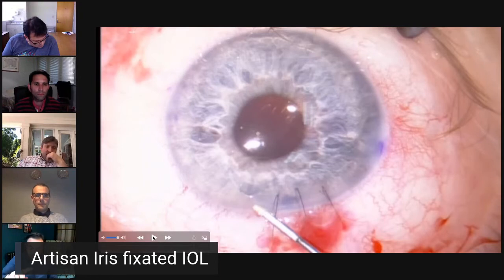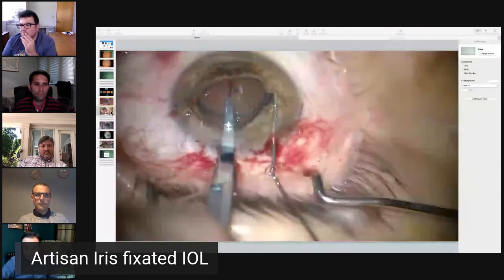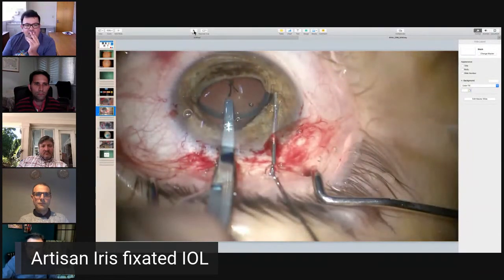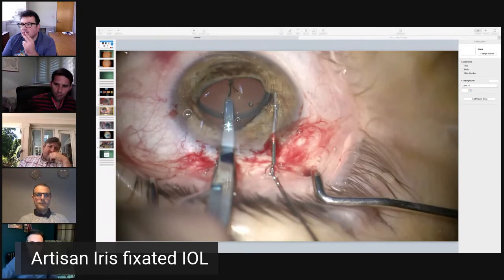One thing, if you don't mind me mentioning, Ahmed, is that you need specific long-tongued forceps to be able to manipulate those lenses. Not any forceps will be able to manipulate those lenses appropriately. Also, one thing I do differently from before is that I tend to use Vicryl sutures nowadays, which dissolve. They're not going to last there for a long time, and that probably has less impact on the tightening and astigmatism in the long run of the corneal wound.